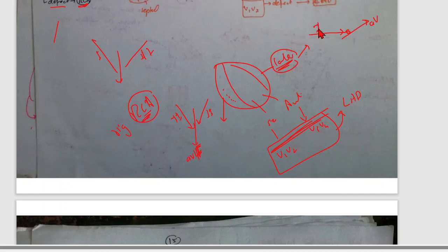Now look here. This is lead 1. This is AVL, and another is V5, V6. If there is any defect in these four, the left circumflex artery will have a defect. Okay, so you have to remember this sketch very easily.